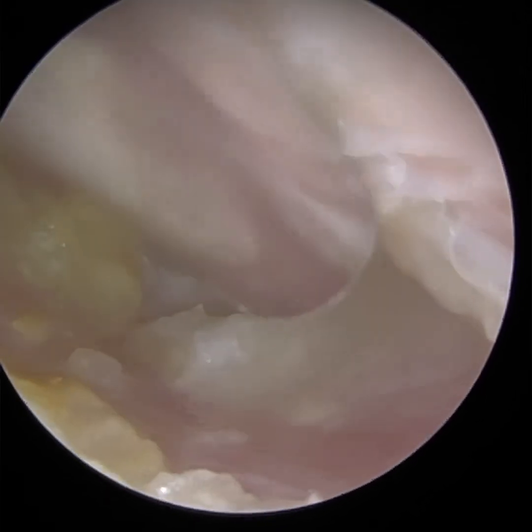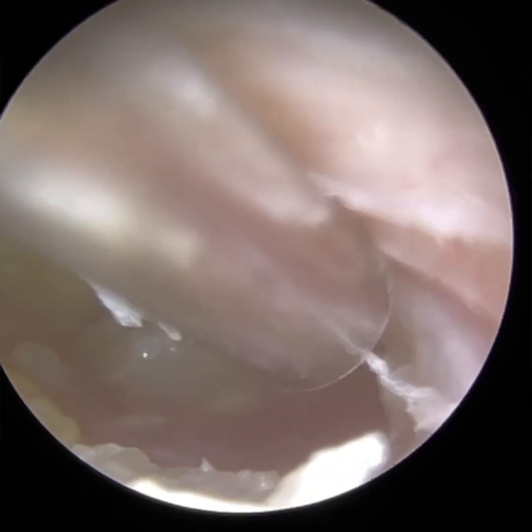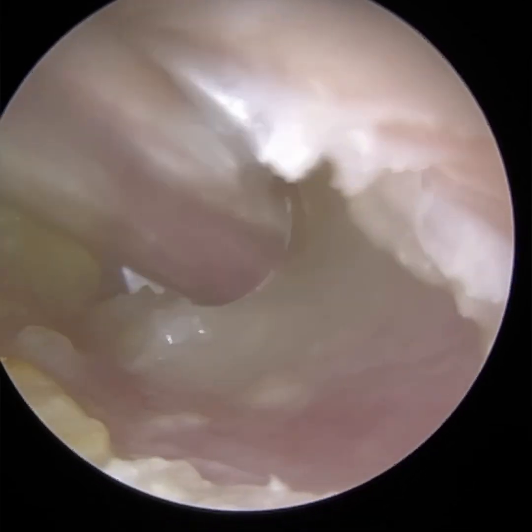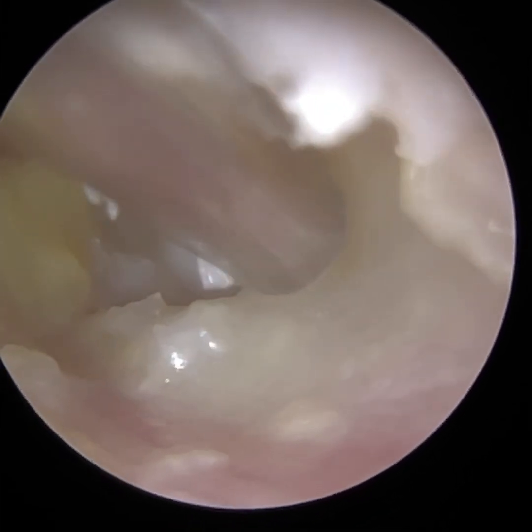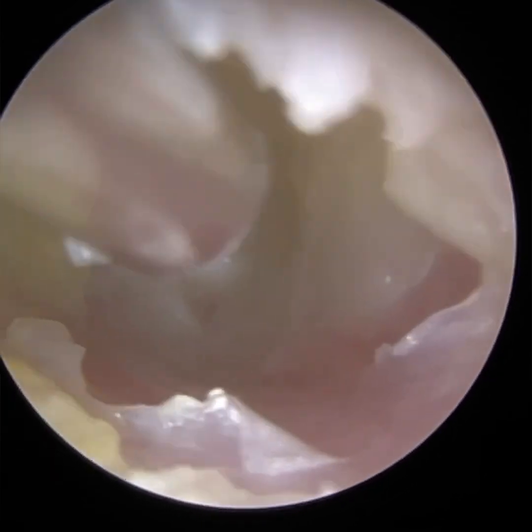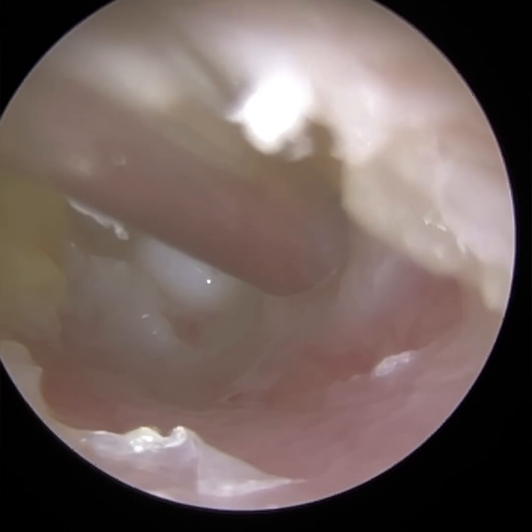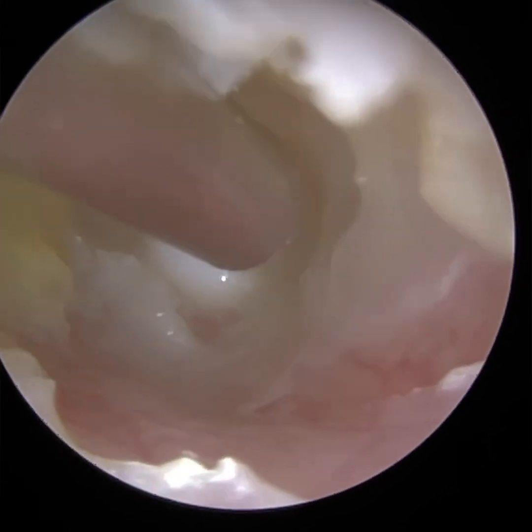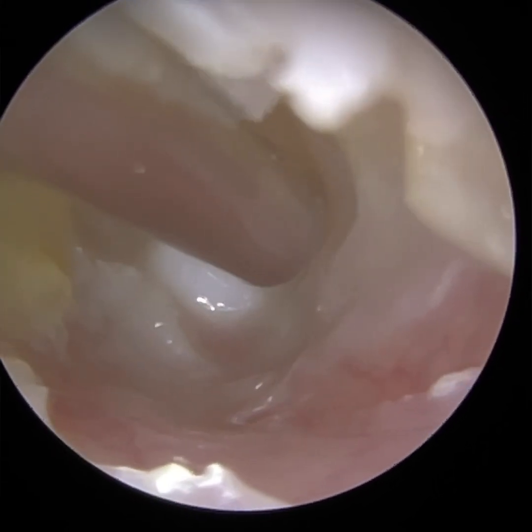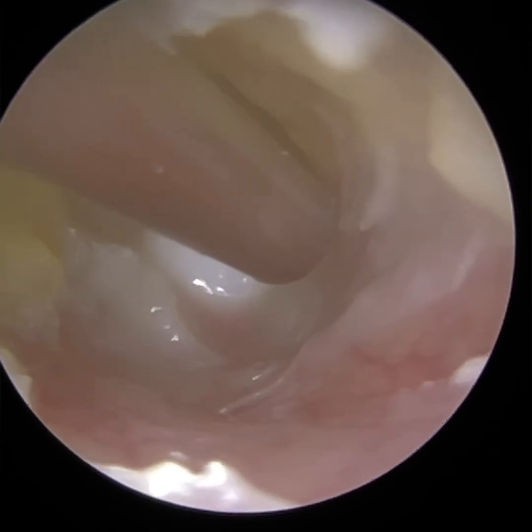So you may be able to see in the distance a white cylindrical object, and that is what we call a grommet. I think in the States across the pond it's called a ventilation tube. And during the course of the video I'll explain what the grommet is, why the patient has it, and I'll also try and discuss the different types of otitis media, because there are different types of middle ear infections that patients can suffer from. So let's begin discussing the grommet.